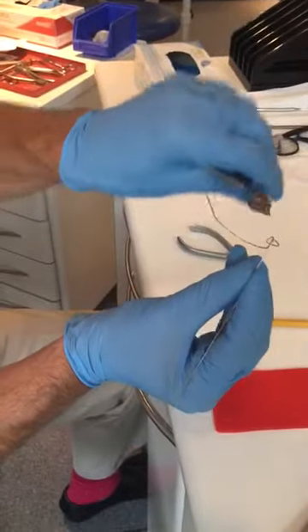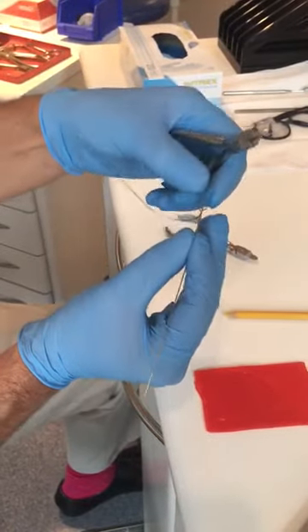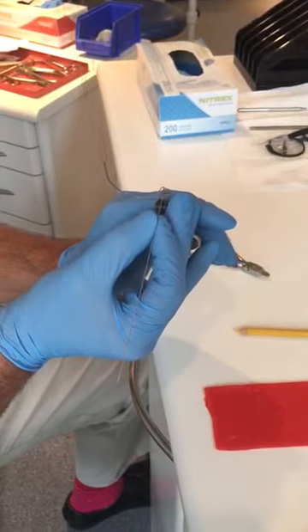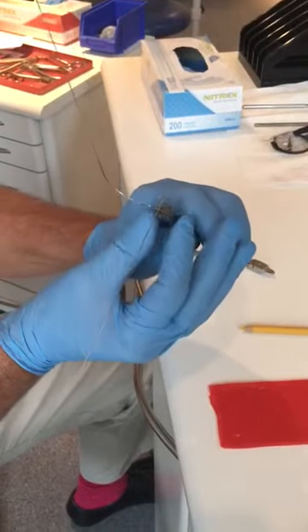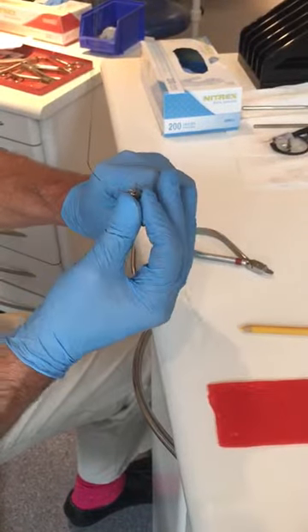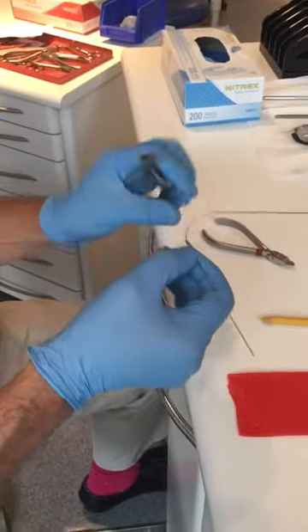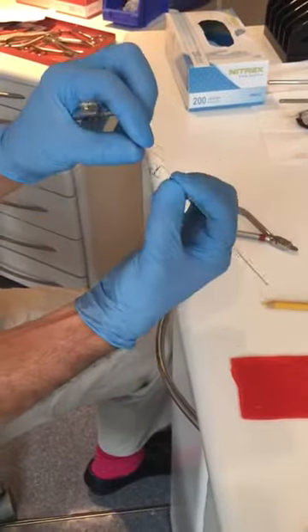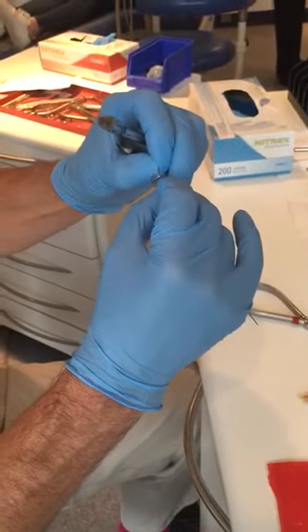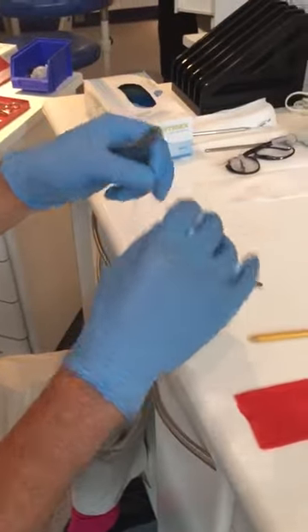So you see how we've got these two bits parallel now. And then, depending on how much intrusion of the upper anterior teeth you want, will determine how much of a vertical step you do. But we usually would end up with about a 2 millimeter vertical step. So if you look at the double delta now, you've got flexibility in the vertical plane because of that loop, and flexibility in the horizontal plane because you can pull it apart.